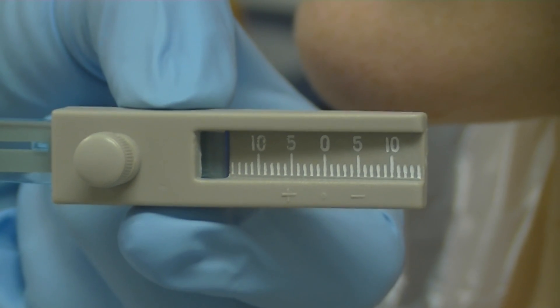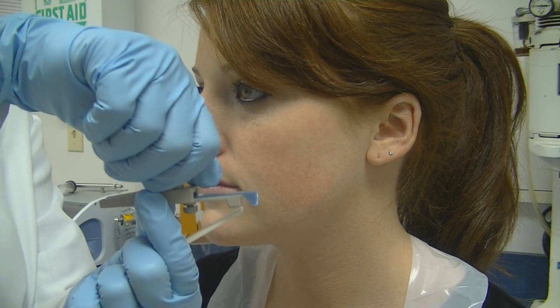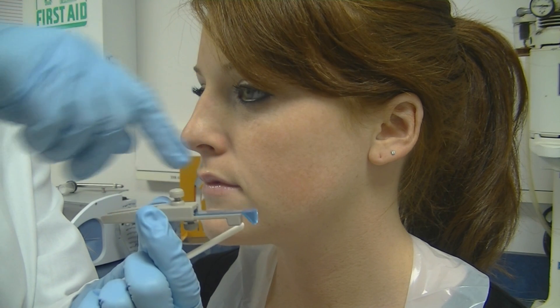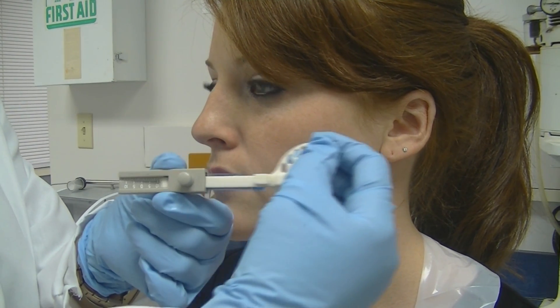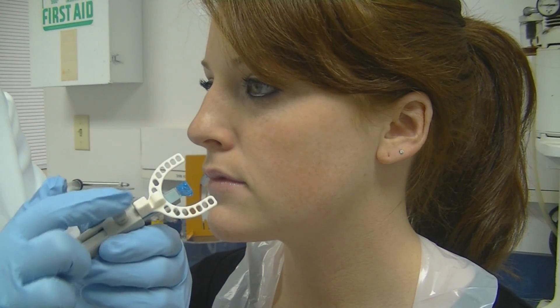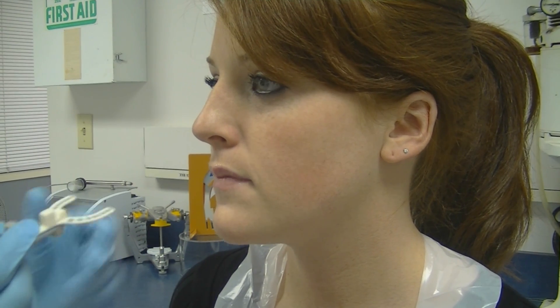On the upper set screw, this is going to have to be loosened because we are going to place — in this case the 5mm fork — so that we can get some range of motion with the patient in a forward and in a retreated position. So the first thing you want to do is loosen that set screw, put the edge of the fork in, and then while it is still not tightened, place it in the patient's mouth.